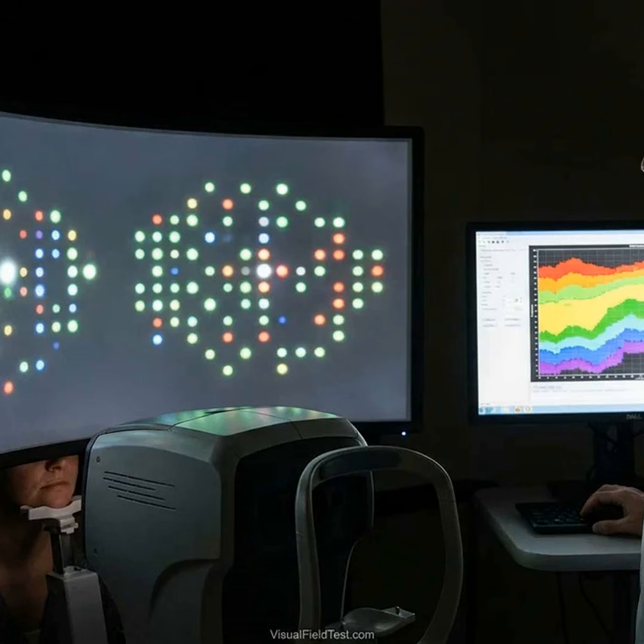Correlation studies show that FDT results align moderately with structural loss. One analysis found FDT sensitivity and OCT-measured RNFL thickness were significantly correlated, Spearman rho 0.65, across all glaucoma patients. In practice, FDT is quick. A screening test takes a few minutes per eye and has demonstrated good early detection ability. More recent matrix FDT devices use full thresholding and can track progression.